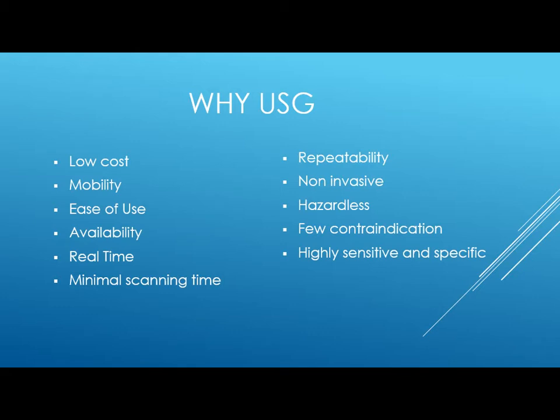It has very low cost, mobility, ease of use, and availability, because not everywhere are you going to have cross-sectional imaging. It's real time. It has a very short scanning time and repeatability, so you can scan many times and follow up your patients. And since it's non-invasive and hazardless, as there is no ionizing radiation concerned, it's highly sensitive and specific.